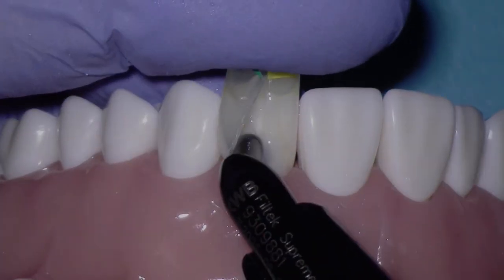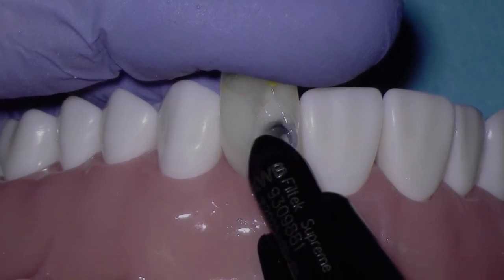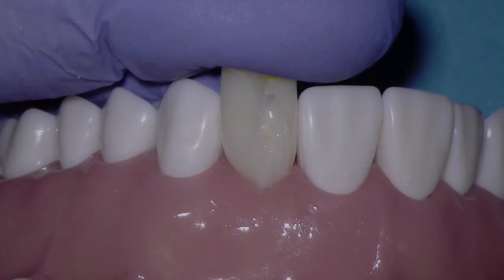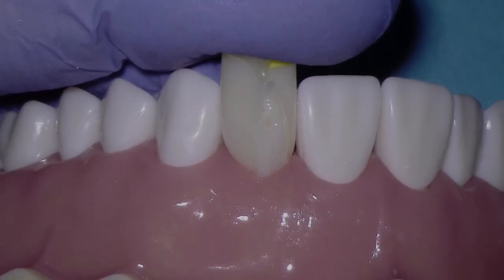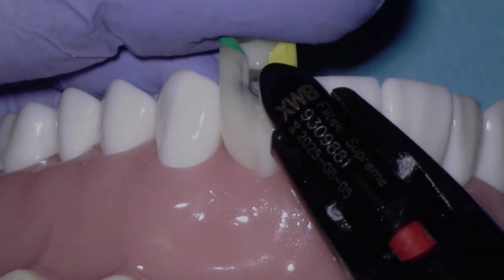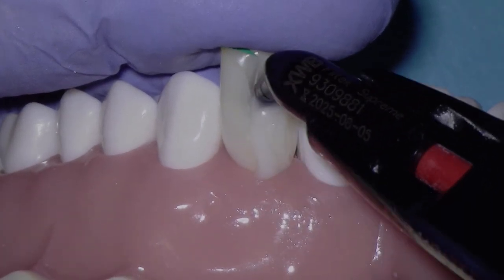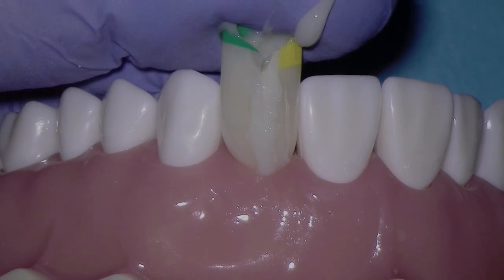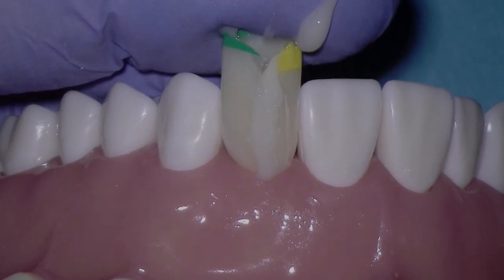I'm going to reach under the matrix, make sure that you're injecting under the matrix. Then I'm going to inject to the left and the right like a window washer. Make sure you're injecting under the matrix. Now I'll come in with a second compule. You'll notice that I'm holding the incisal edges of the matrices while I'm injecting the paste. At this point, I'm going to begin to pivot from a facial direction to more of an incisal direction. You want to slowly change your angle from the facial and slowly pivot it toward the incisal.